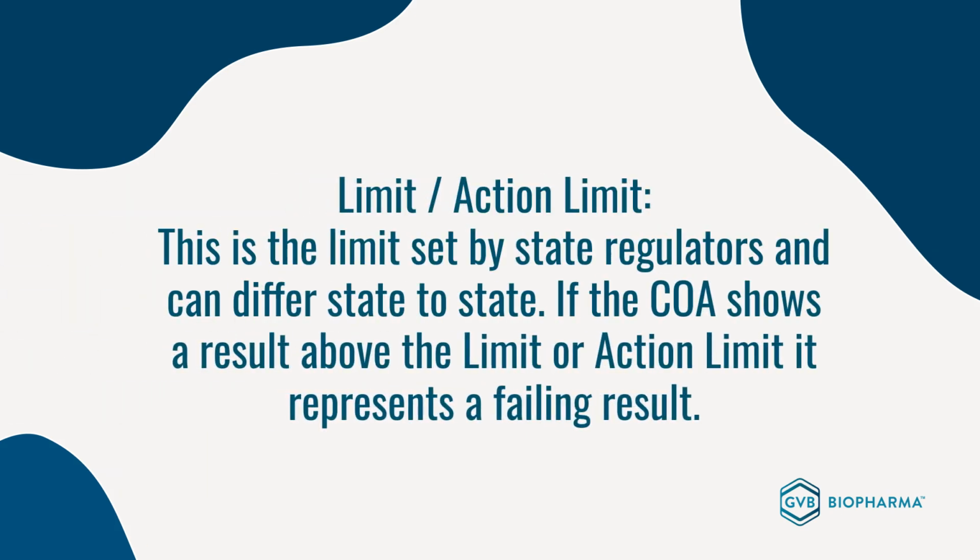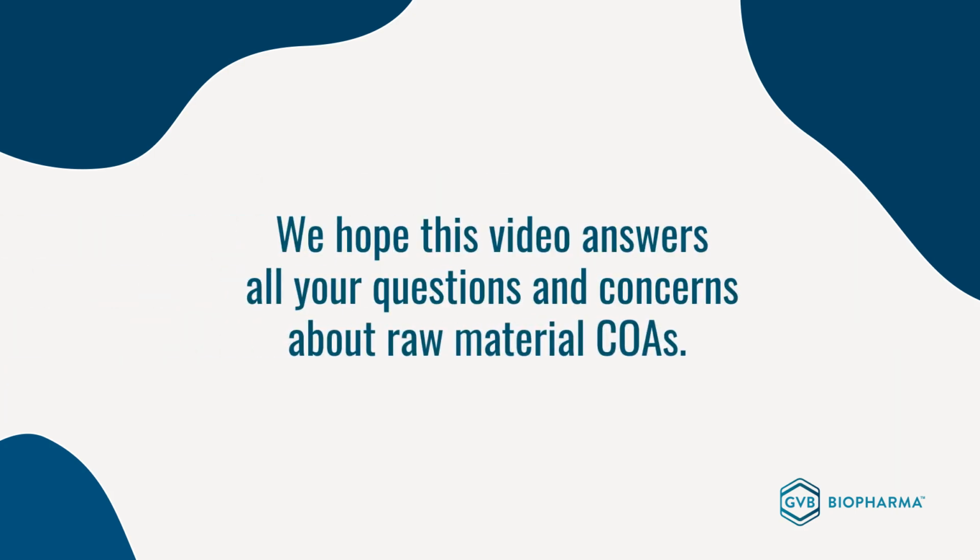Limit, action limit. This is the limit set by state regulators and can differ state to state. If the COA shows a result above the limit or action limit, it represents a failing result. We hope this video answers all your questions and concerns about raw material COAs.